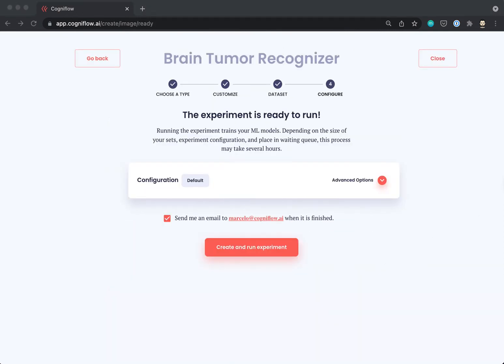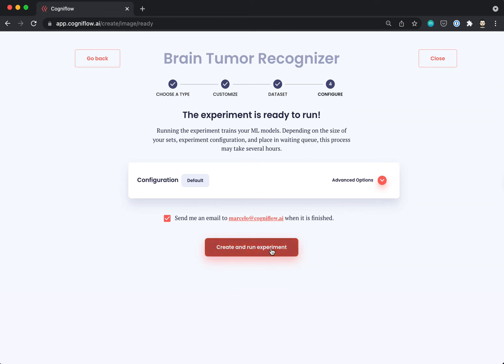Now, we are ready to tell CogniFlow to start the training, where it will create automatically different machine learning models. In this example, it is going to take a few minutes, so we can tell CogniFlow to notify by email once the experiment is finished.